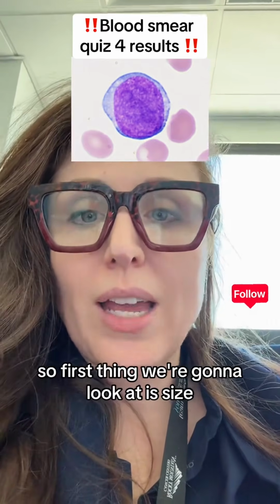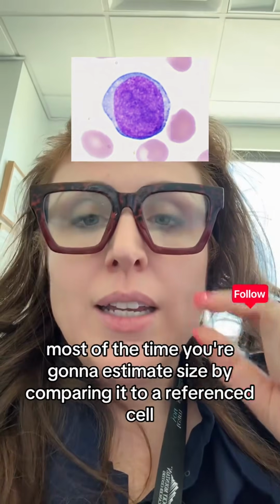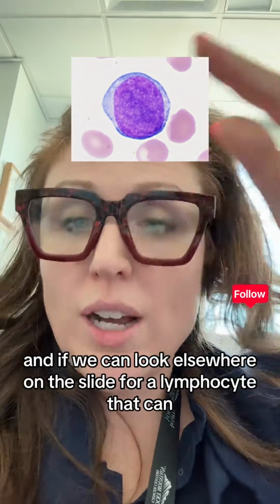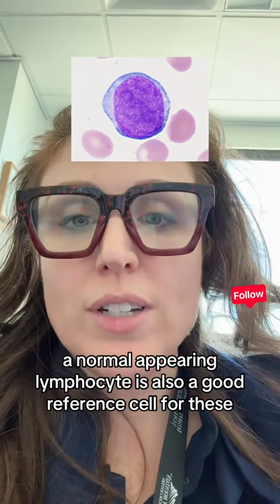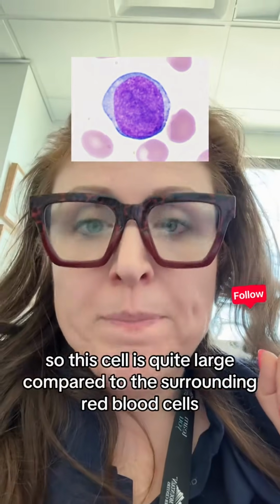So first thing we're going to look at is size. Most of the time, you're going to estimate size by comparing it to a reference cell. In this case, we can compare it to the reference red blood cells that are nearby, and if we can look elsewhere on the slide for a lymphocyte, a normal appearing lymphocyte is also a good reference cell for these. So this cell is quite large compared to the surrounding red blood cells.